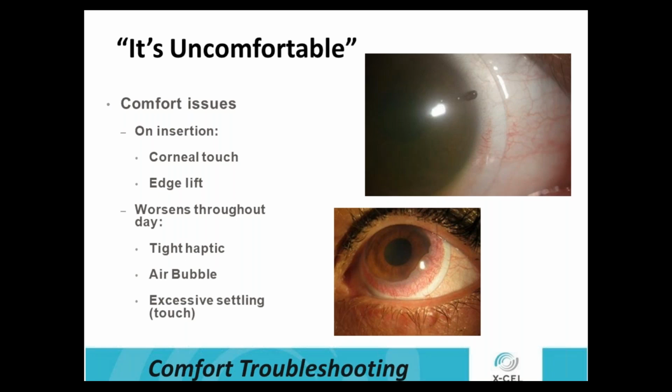When we take that pressure off and we apply a scleral lens, and now that cornea starts to rebound, if we haven't had enough central clearance at the beginning of the fitting process, we may have corneal touch when the patient comes for that follow-up, or even 2-3 months later. There's not a real good determination of how long they wore a corneal lens to how long it takes for that cornea to rebound. It's different patient by patient.